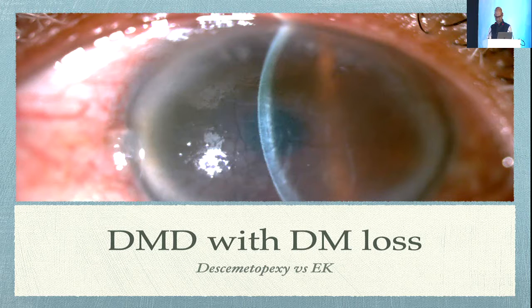Sometimes you can't make out the Descemet's detachment. OCT comes in very handy. If you're seeing unexplained edema, just image that area, and often you'll see a hidden Descemet's detachment like this.